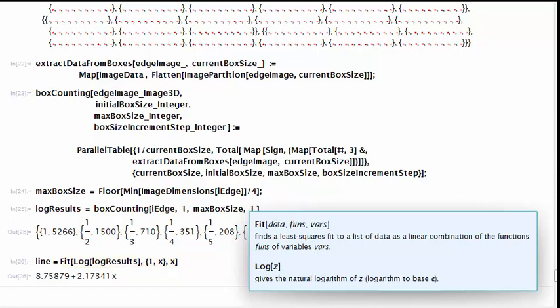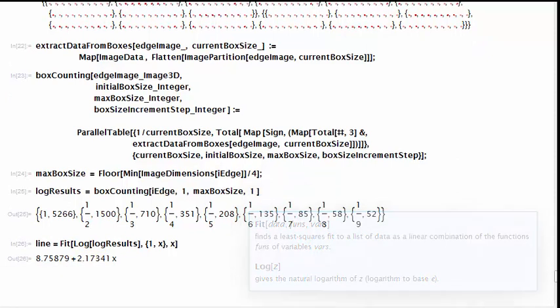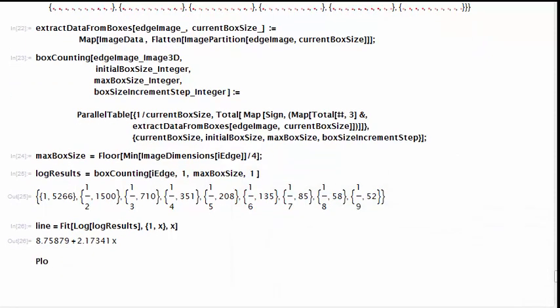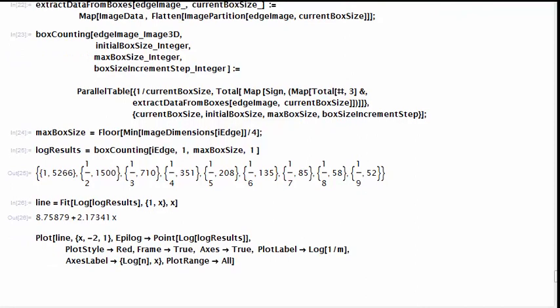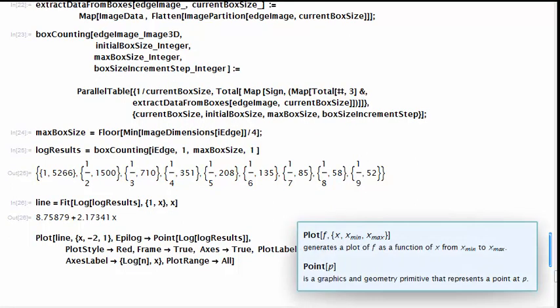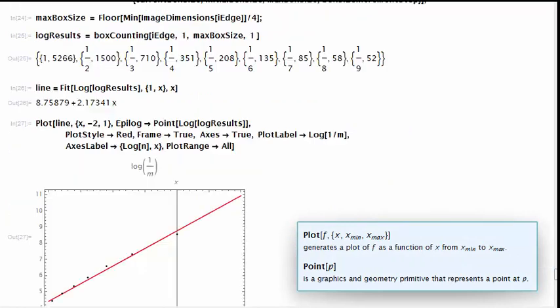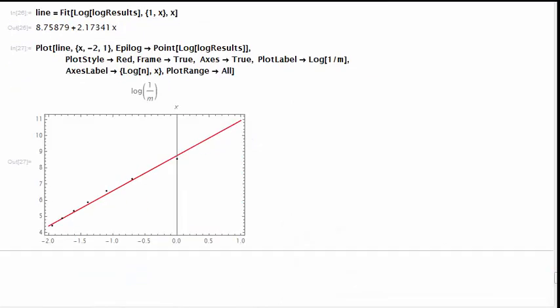The estimated fractal dimension with box counting is the coefficient of the x. You can see that it's 2.17, which is higher than the topological dimension of a sphere, so we made a sensible estimation for the rugosity of the tumor. However, one of the big faults of the box counting method is that we can have a value that's lower than 2 here using different minimum and maximum box sizes, and I invite you to try to find them.